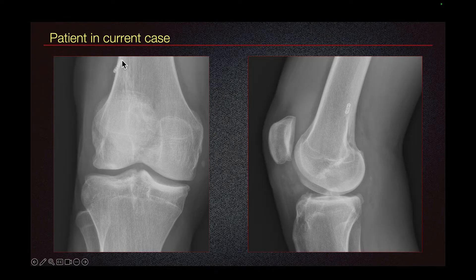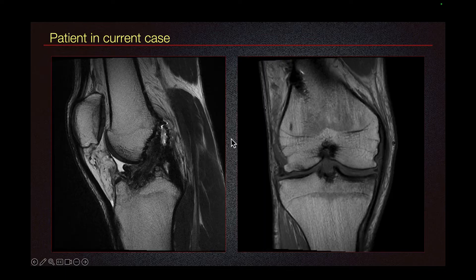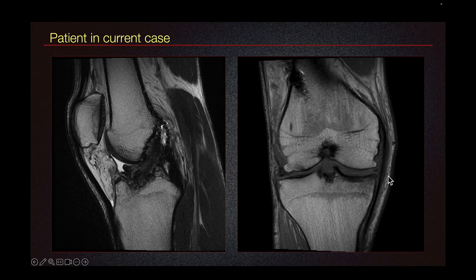This button is related to ACL reconstruction. In CPPD arthritis, classically we see chondrocalcinosis, which we do not see in this case. This patient also has a large knee joint effusion. The ACL graft that we see here shows no high grade tear. We also see tear of the lateral meniscus. The medial meniscus is severely attenuated, consistent with either prior surgery or a meniscal tear.